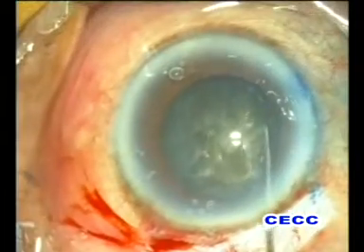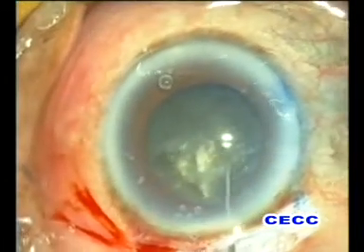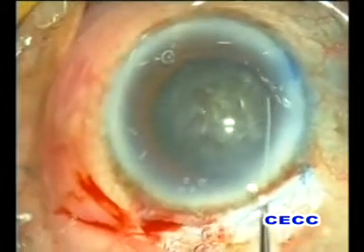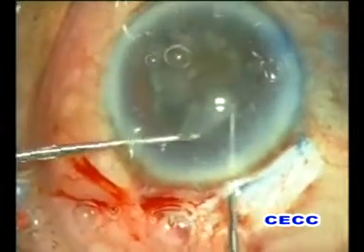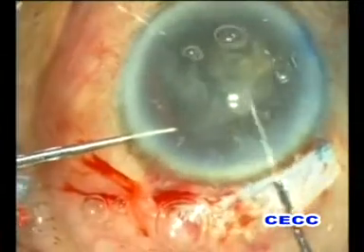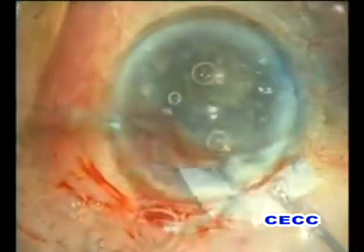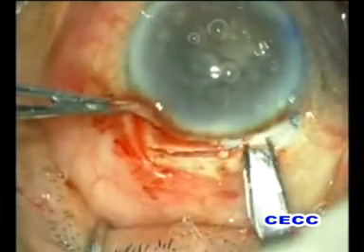Hence we planned to convert to a non-phaco technique of nucleus management, which appeared to be the safest option in the given circumstances. We resorted to the two-hook technique. The nucleus was delivered out of the bag into the anterior chamber. All these manipulations were performed under adequate viscoelastic cover to protect the corneal endothelium.